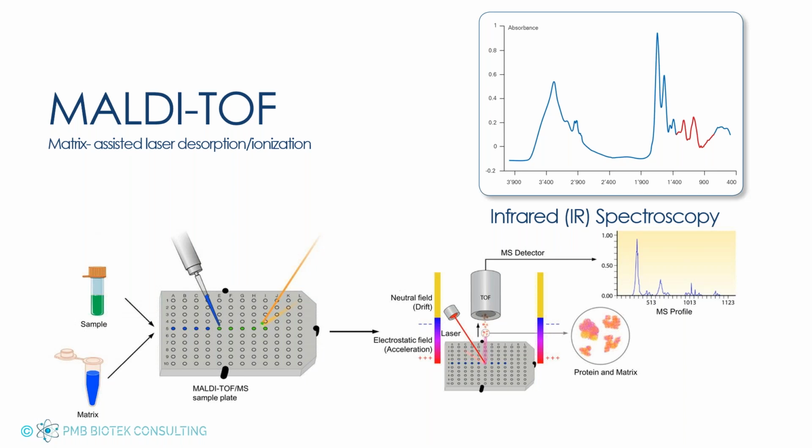Both of these are chemistry technologies, and they're being adopted in the micro industry to essentially ID organisms or detect organisms in a more rapid manner. MALDI-TOF right now is a validated technique to ID pathogenic organisms from agar plates, and they're looking to start to transition that into more complex matrix samples for rapid detection.